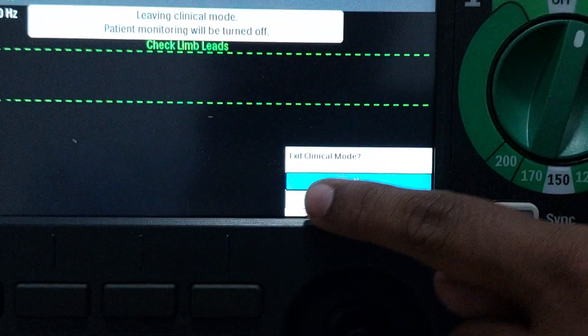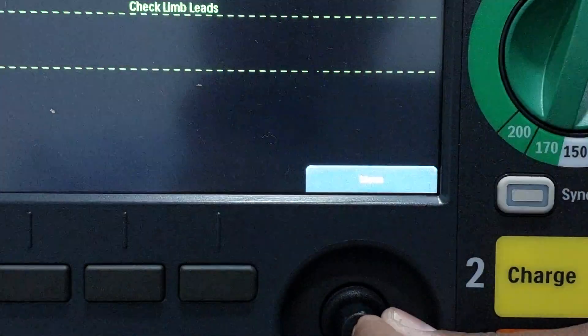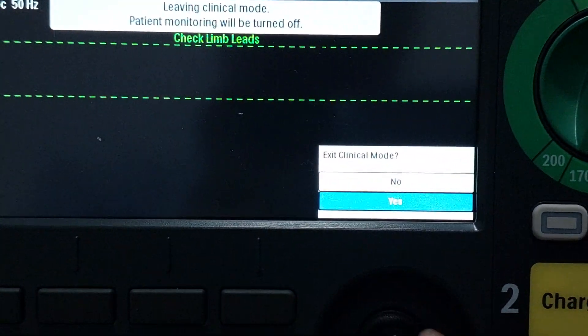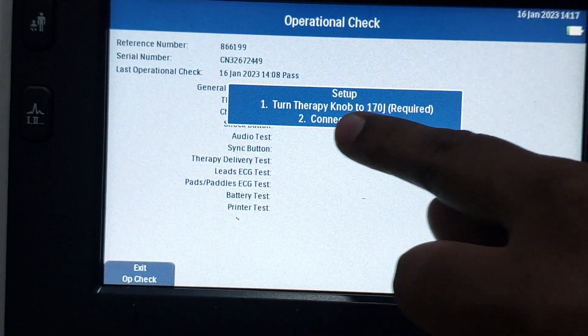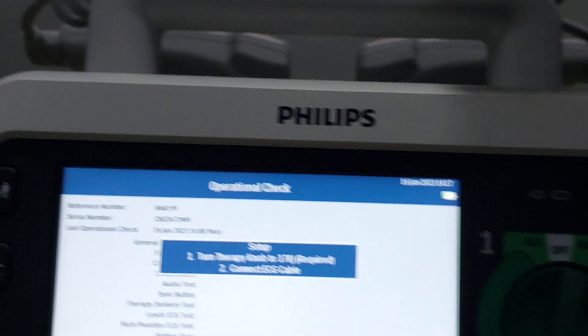Now read the instructions on screen. It will say 'Exit Clinical Mode' — select Yes. Now you have to read and follow the instructions displayed. It will say: 'Setup therapy knob to 170' — just set it to 170. Read each instruction and perform accordingly.